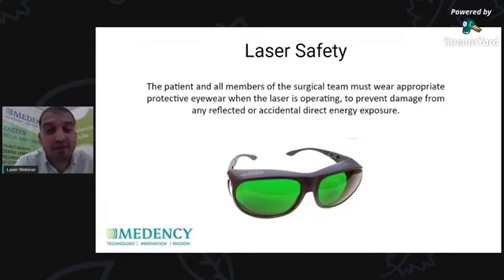Every laser has its specific goggles, and these goggles come with the device. They have a specific wavelength, work with the diode laser, and we should note that there is a writing on every goggle that says it suits the following wavelength. So the first thing is wearing eye goggles for you, for the patient, and the dental assistant next to you.